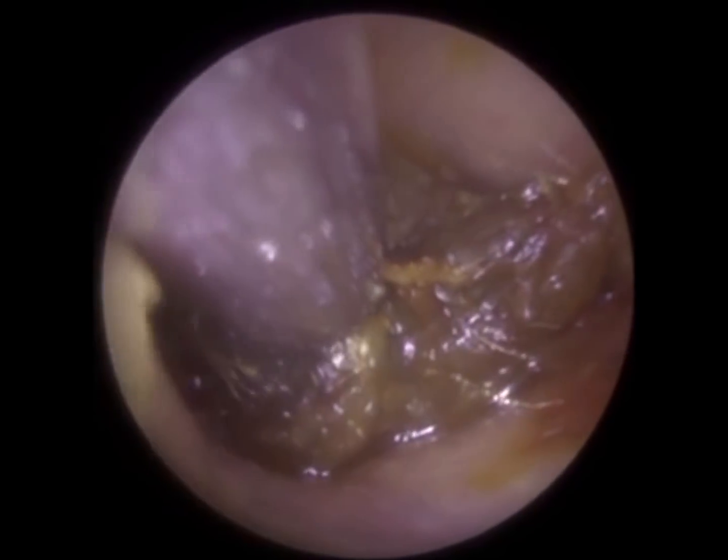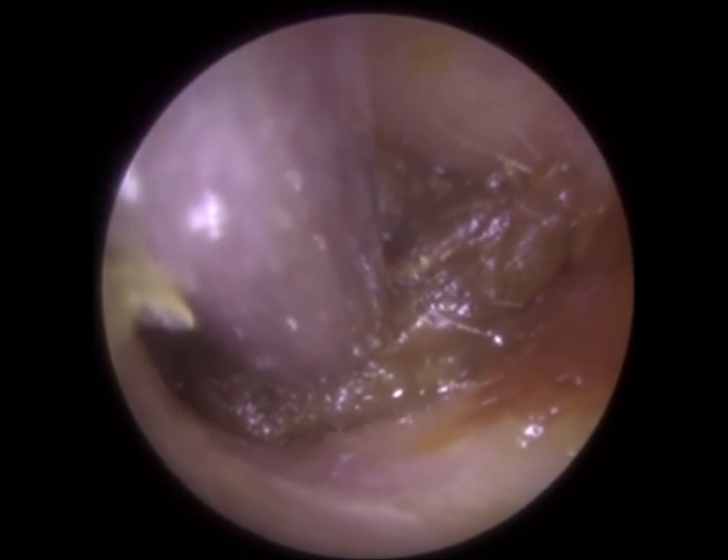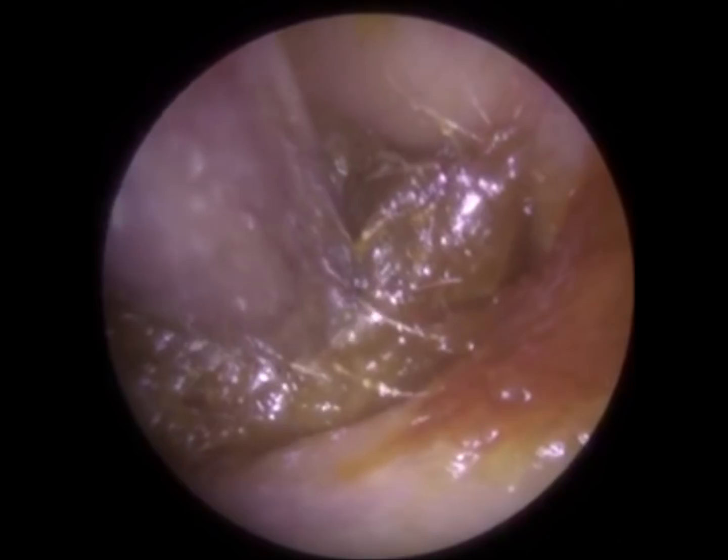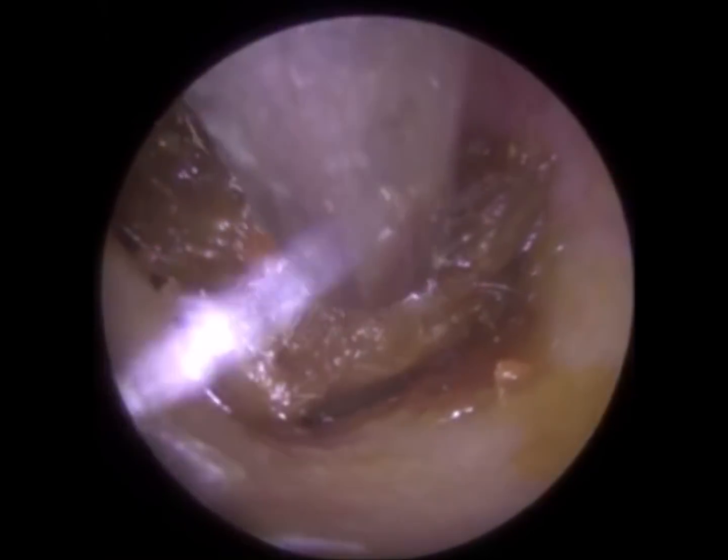So the patient had been using drops as well, but it's very impacted. It's lodged in the isthmus, so there's a narrowing about 0.5 centimetre away from the eardrum, where the ear canal narrows and then it protrudes outwards. So the wax got lodged.